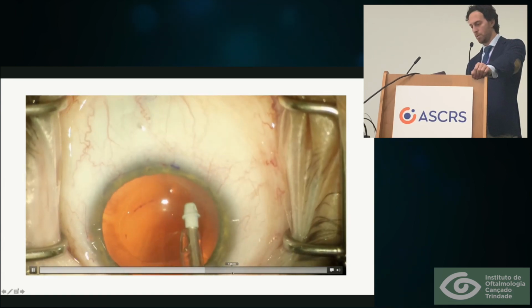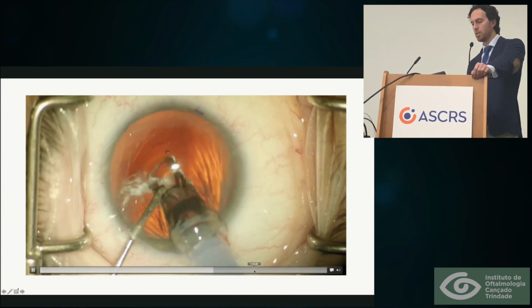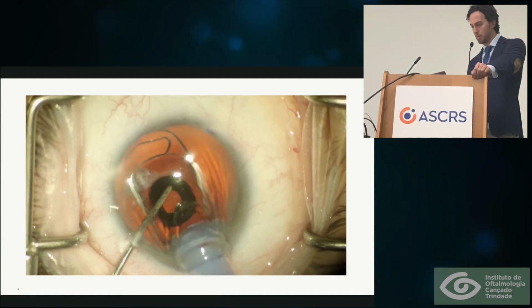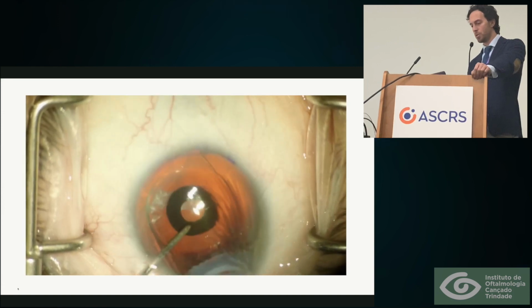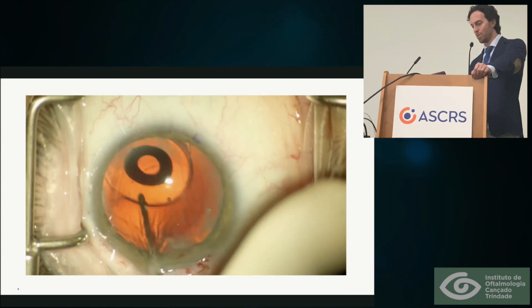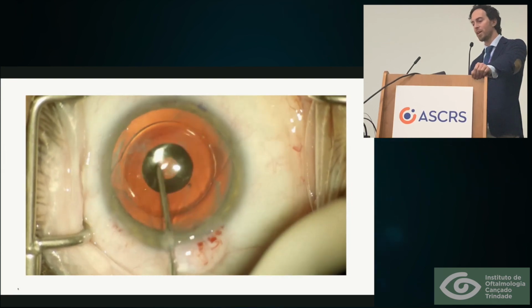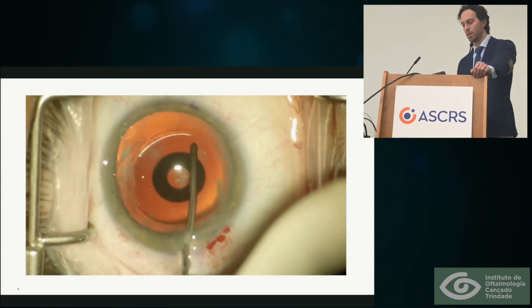So at the end, what we did is we put the lens, which needs a bigger incision, 3.5, and sometimes bigger, something that they need to work on, but at the end it's pretty acceptable and it goes directly to the back. So I think that both technologies are completely complementary. It's a field that is growing and it's making everything for us much easier. I think they are going to be brothers.